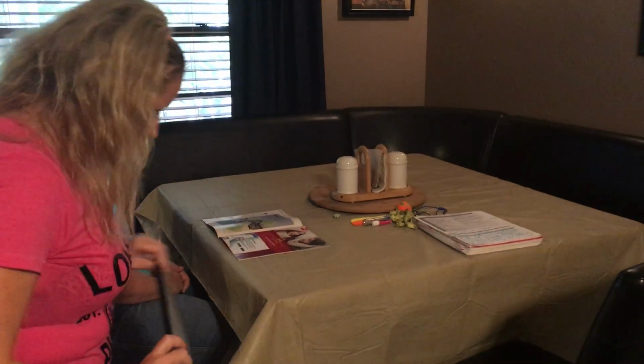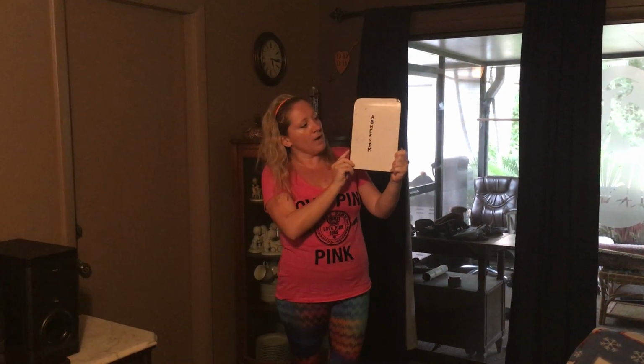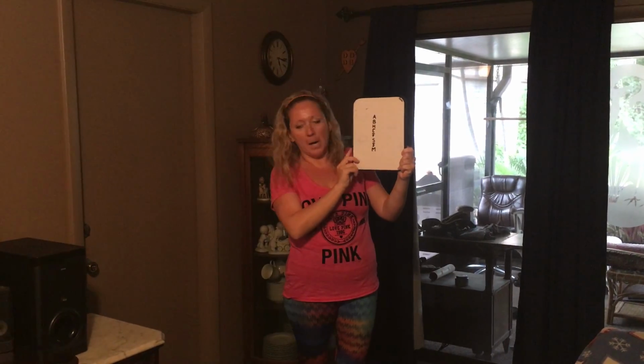Okay, so for the next one, I'm gonna bring that right forward. It actually would be about 20 feet away, so 12, 13, 14, 15, 19, well, it's about 20. So I put a half an inch size of the letters on this board. So try to read it from the top to the bottom for me, if you can.